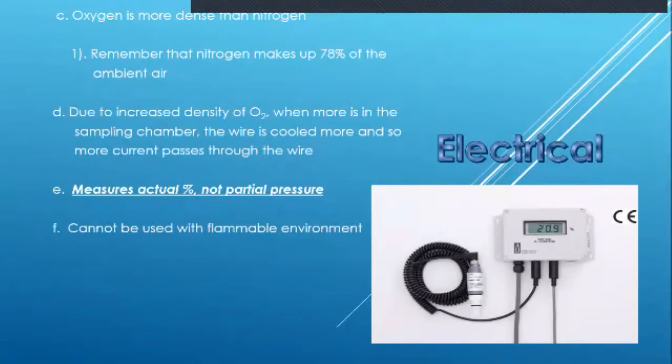I'm just saying. All right, it cannot be used in a flammable environment. Of course, it's electrical and all of that, so don't use it in a flammable environment. But this is the electrical analyzer. It measures percent and not pressure.